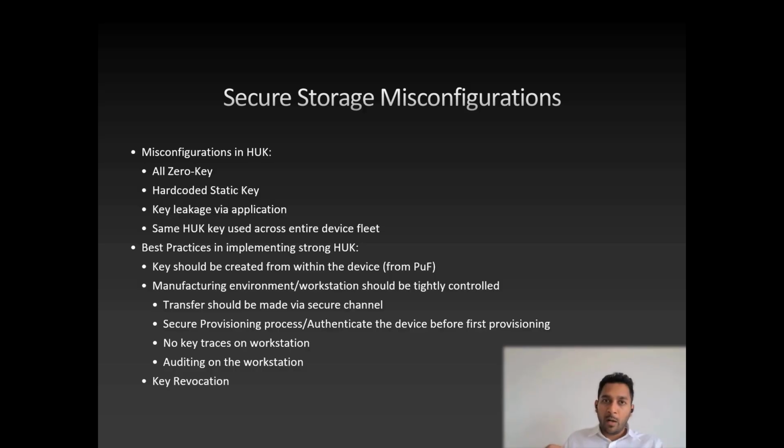During the manufacturing line, upon first-time running, the device checks for the key's presence. If it's not there, it will call that function. The function will use cryptographic accelerators to generate the key and store it in the designated location. That's what the internal firmware should do. It means the key is never exposed outside and never leaves the SoC, the system on chip.